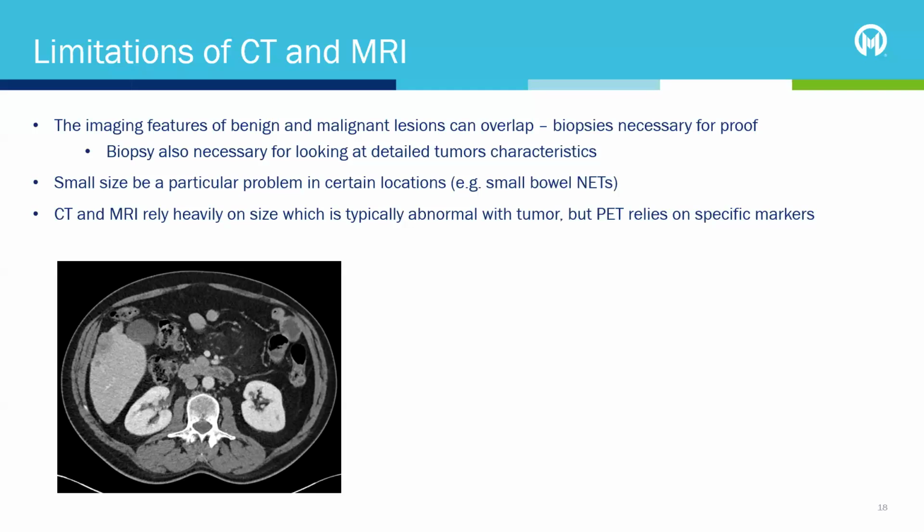When you think about small bowel neuroendocrine tumors, we can optimize CT scans to look at the bowel and find extremely small lesions, but any neuroendocrine tumor surgeon is not concerned about that, because standard of care for neuroendocrine tumor surgery is they get their fingers on every centimeter of that bowel, and that's how they find them. We may look at imaging and say that there's, in reality, 20 small lesions in the bowel that are neuroendocrine tumors.